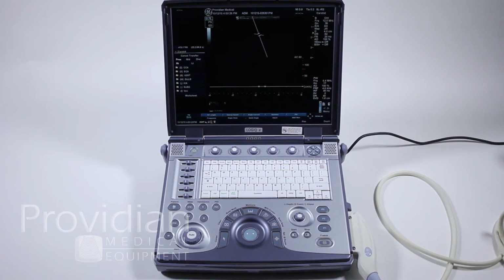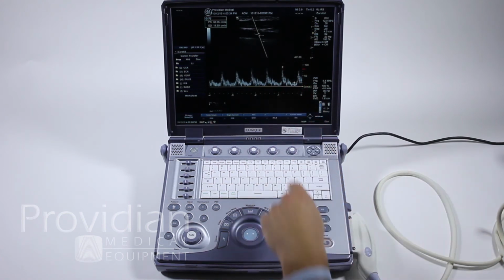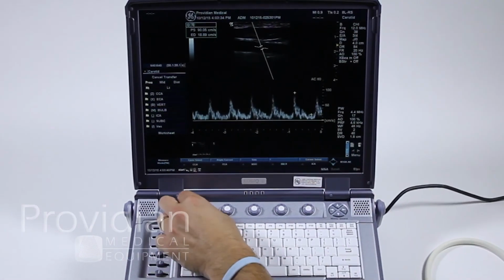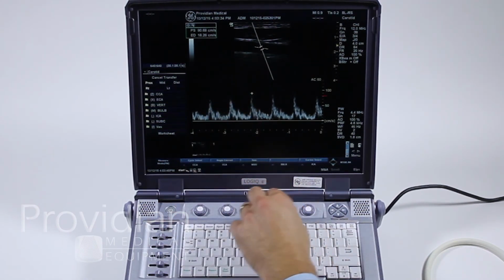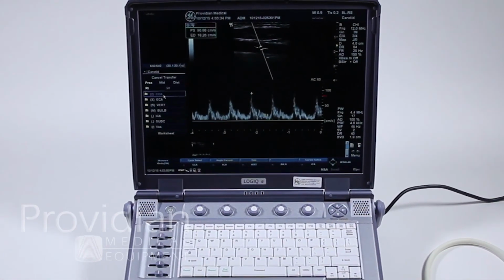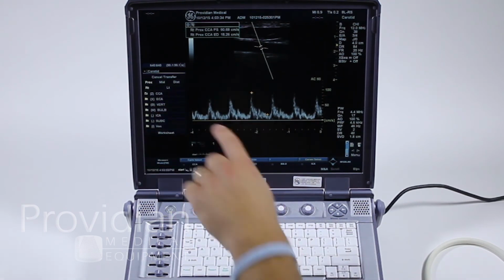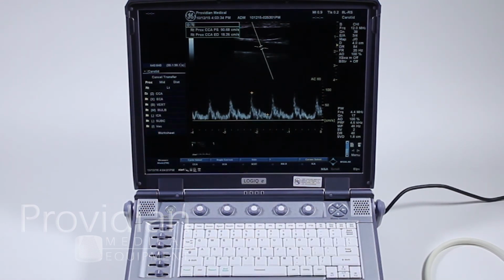So let's go to a live image here and show you how to save the measurements. So you can see how the AutoCalc came along. Well, first I can choose my cycle select, and it will go to various cycles and change which one is selected. Next, I want to assign that measurement. So here I've assigned it to right proximal. So it says proximal right CCA. And now, since I've clicked on that, there's a check mark showing that I have made that calculation, and it will show up in the worksheet.